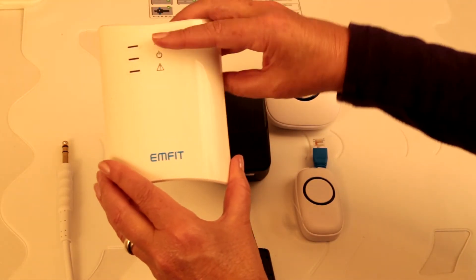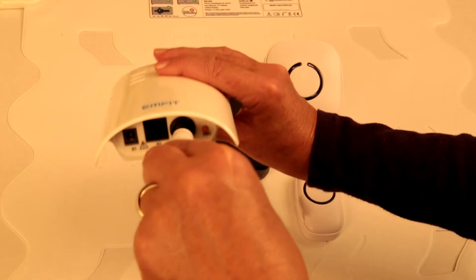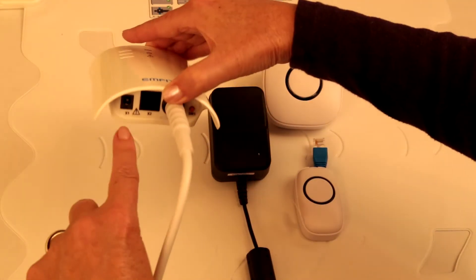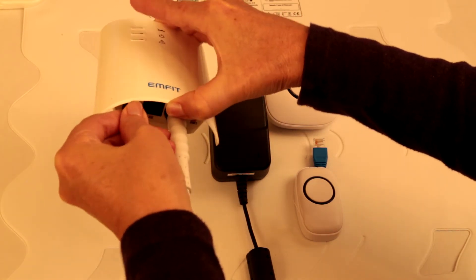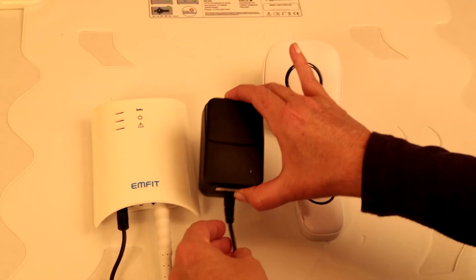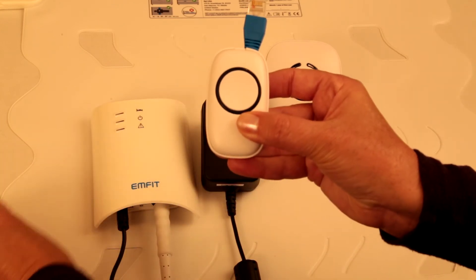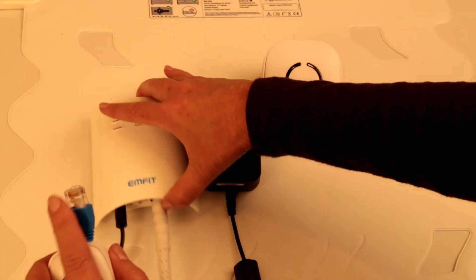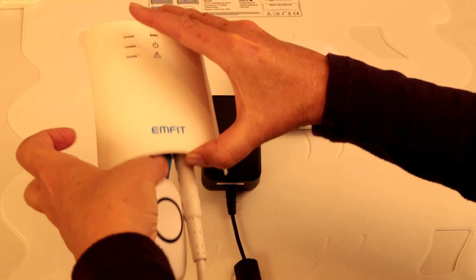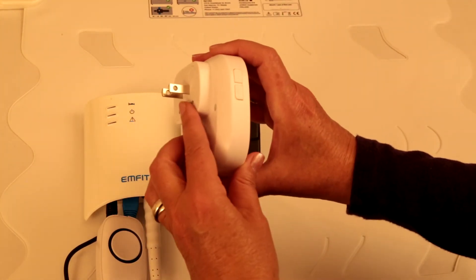Now we're ready to connect the Mfit bed sensor, AC adapter, and remote alarm to the Mfit control unit. Firmly plug the Mfit bed sensor cable into the correct connection point located on the underside of the Mfit control unit. Next, you'll connect the AC adapter to the X1 connection point. The adapter will plug into a wall outlet at bedside. Next, remove the tab from the remote alarm transmitter, then connect into the X2 ethernet connection point. You'll hear a click to let you know it's firmly in place. The remote alarm will be plugged into an electrical outlet and you'll have a range up to 500 feet from the Mfit control unit.